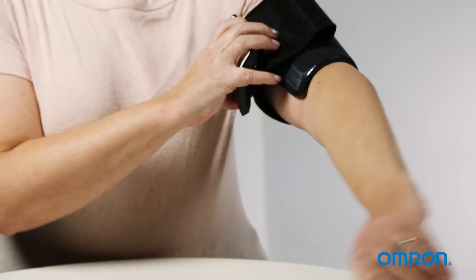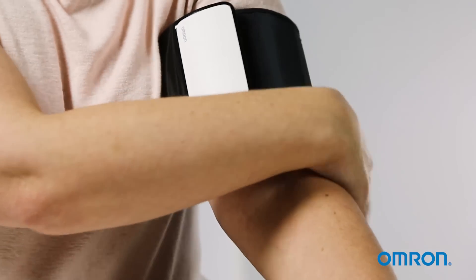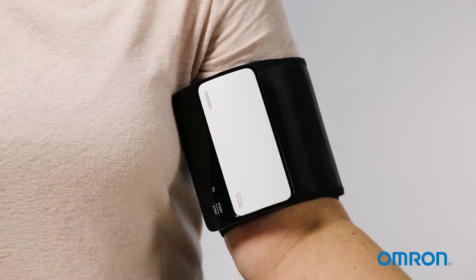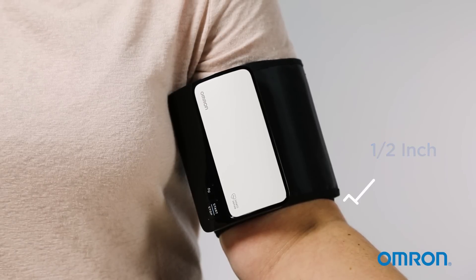Sit comfortably in a chair, keeping your back straight and your feet flat on the floor. Place the cuff on your left upper arm one half inch above your elbow. Securely close the cuff using the fastener.